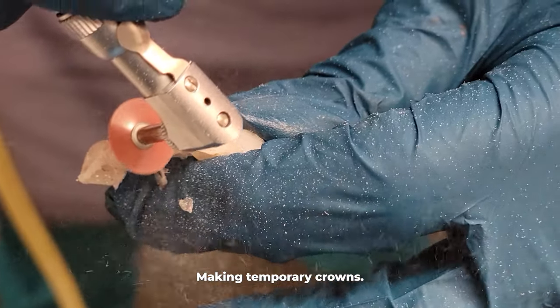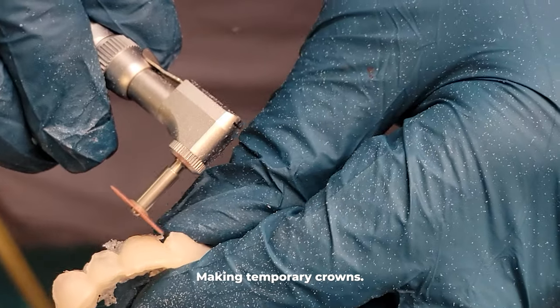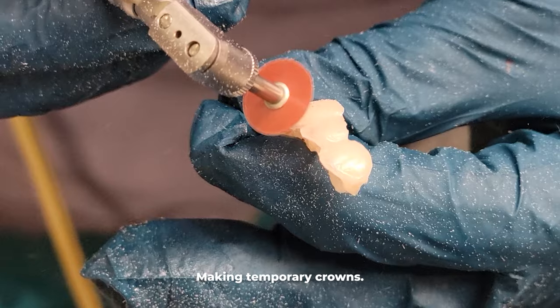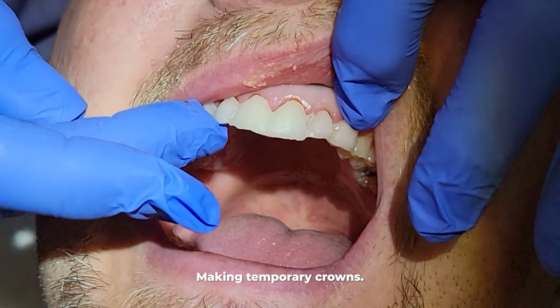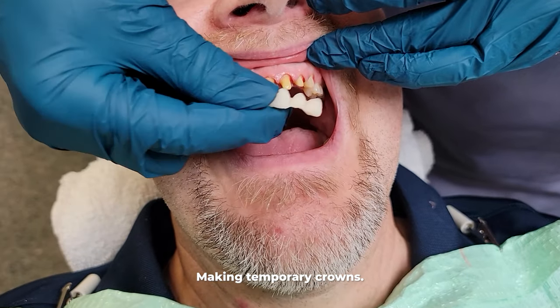However, the color of the temporaries will be whiter than his original teeth, so they will be slightly more cosmetic when it comes to color. That said, it is possible to have more cosmetic temporaries than what you will see here, but because of the extra cost, most patients opt for these makeshift temporaries patterned after the original teeth.